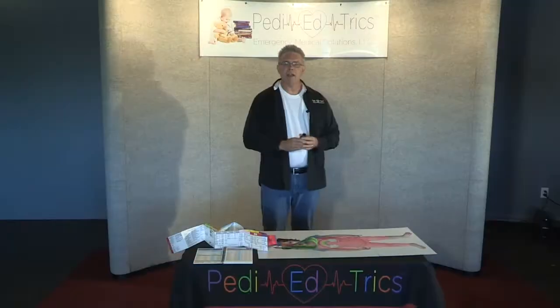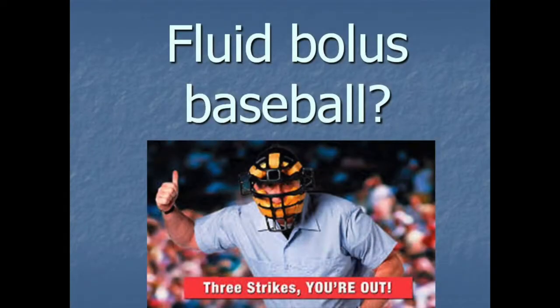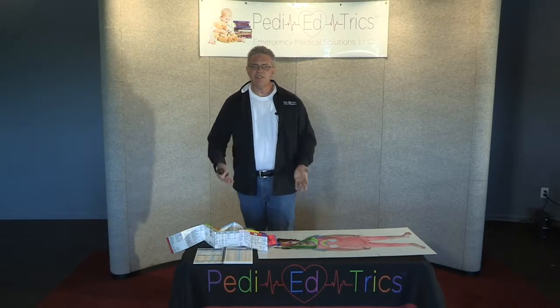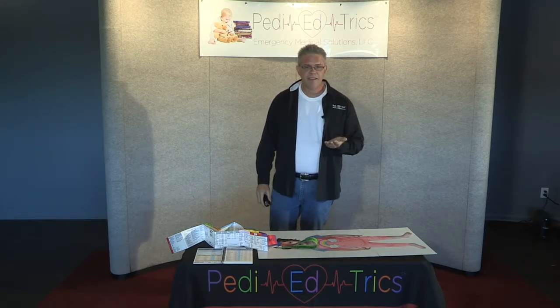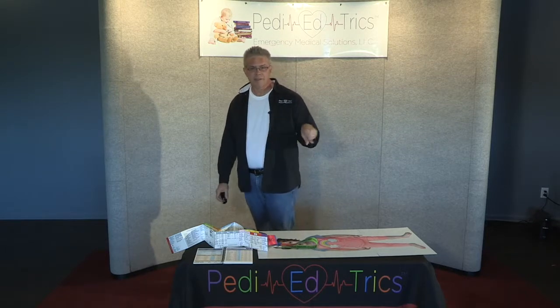But you also, when it comes to kids, just like adults, with few exceptions, you want to play baseball. Meaning three strikes and you're out. Meaning, for most kids, three hits of fluid should be more than enough to fill up your tank. And if you still look crummy after three hits, you know what? You probably need something else.